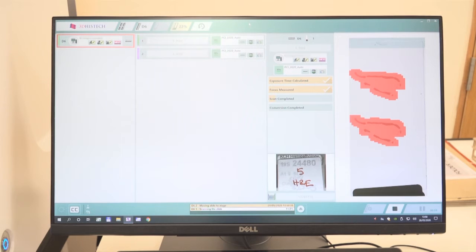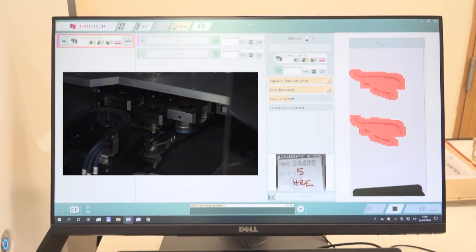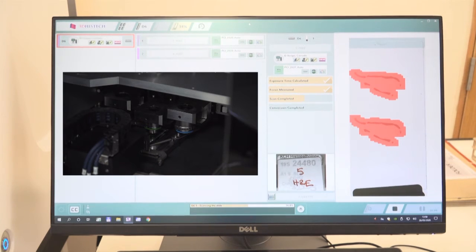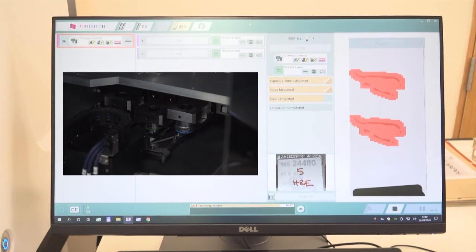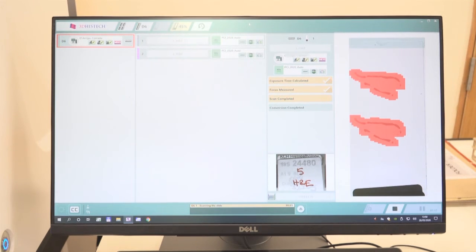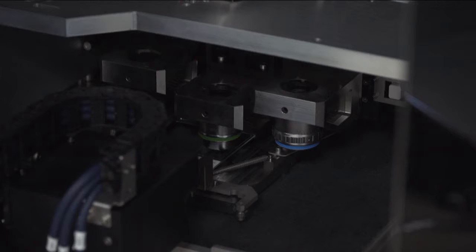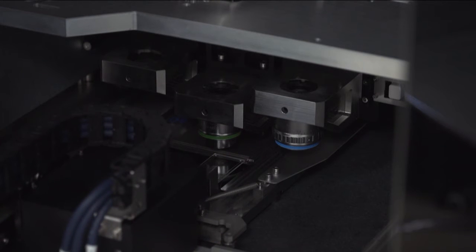And after that, we start scanning. You can see on the insert how we scan. It's a very fast process using a flash lamp, so the stage moves continuously between the different shots. Once the scanning is completed, there is a cleanup and optional conversion, and the slide is taken out.